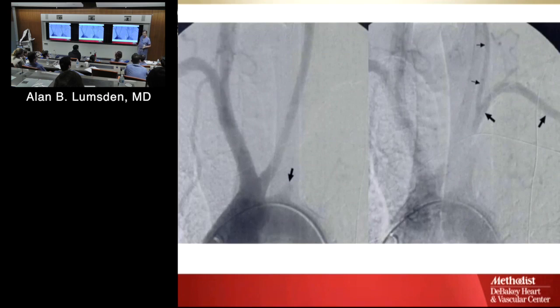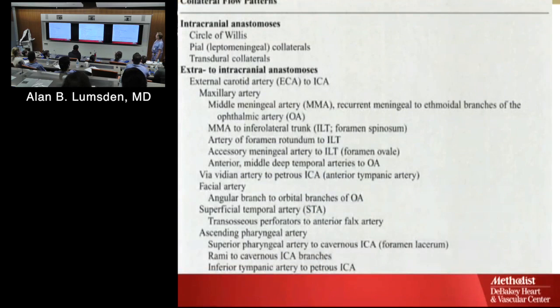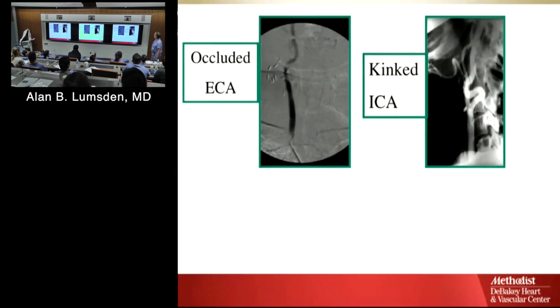You don't want to do endovascular 1, endovascular 2, and endovascular 3. You could, but you're probably better off bypassing. It's a little shaky going through a long occlusion here, because this is full of thrombus. So we'd probably bypass them. And if it was a stenosis, we'd put a stent in. But these occlusions are a little more hazardous to actually take on. I don't want to do that.